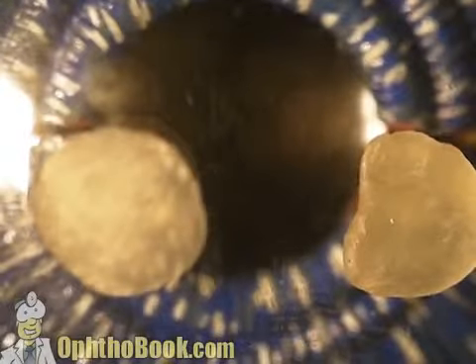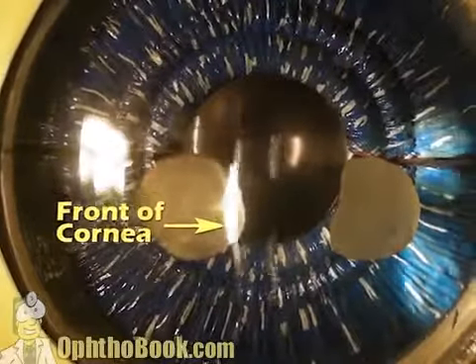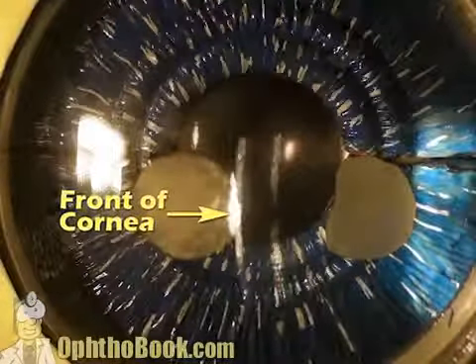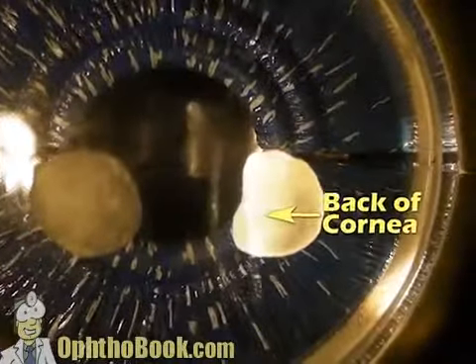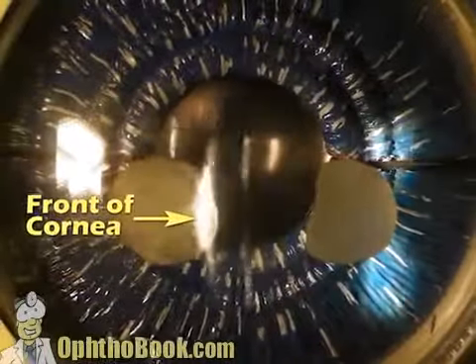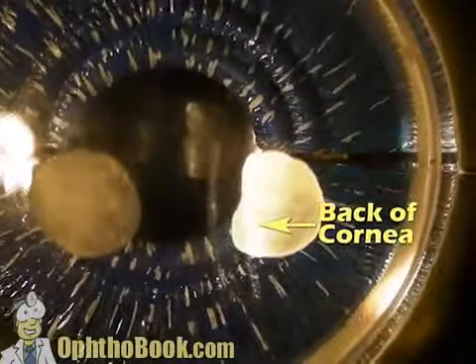Now I've stuck 2 lesions to this model, but are they on the outside of the cornea? Are they on the inside of the cornea? Well, we can actually use our slit beam to tell. And if we go across, you can see that the front lights up here, and if we go over to the other one, we can see it lights up on the back surface of the cornea. And so a very good way to judge depth and to judge the location of lesions by using our cross-sectional beam. And moving on to the back.